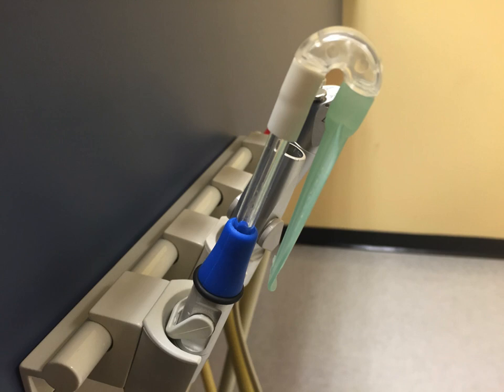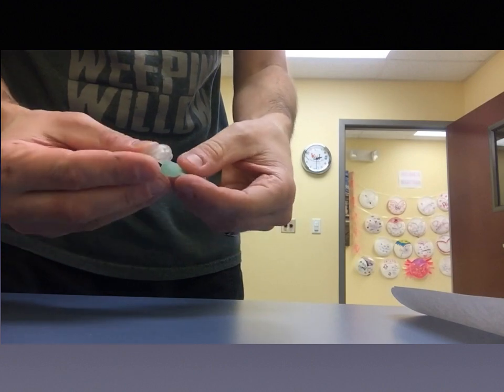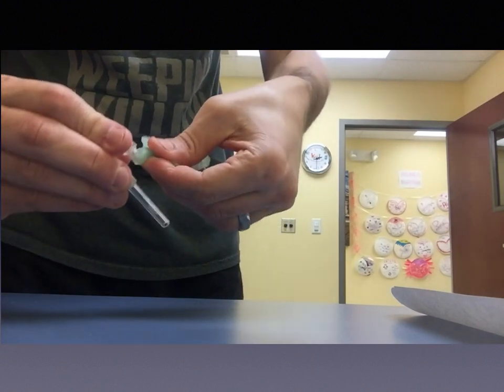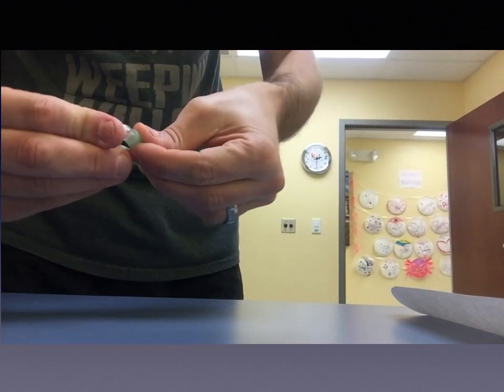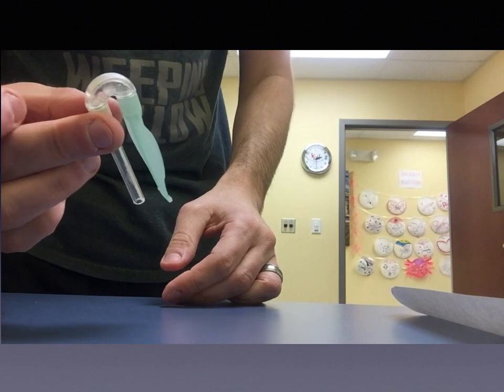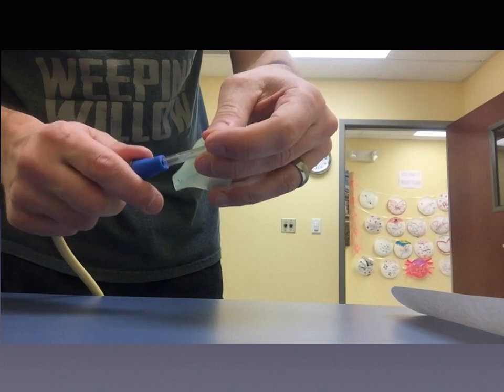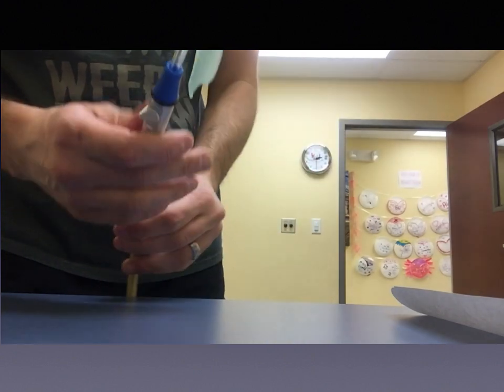Here it is in your saliva ejector valve, ready to go. When you're flipping it from the left to right side of the patient, nothing changes — you just flip it. It's pretty simple. In the assembly video you can see it goes on a little tight and you have to push it in a bit, but not too bad. You don't want it to slip off in the patient.